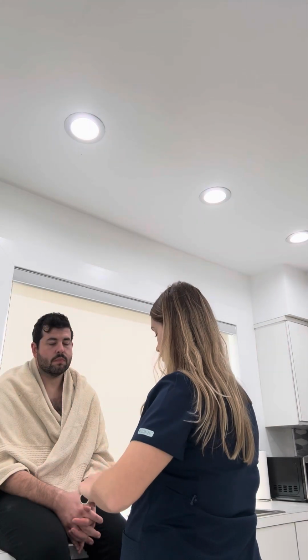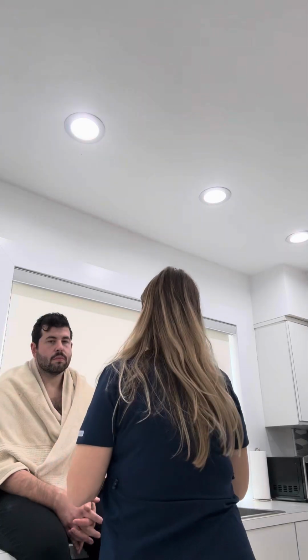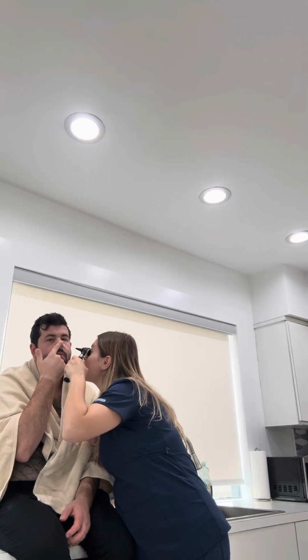Now I'm going to be looking inside of your nose. Okay. Septum is midline. No polyps or protrusions noted. No excess drainage noted. Now we'll be doing the same thing. Hold it back for me. Same thing on the other side. Okay. Good. Normal findings.